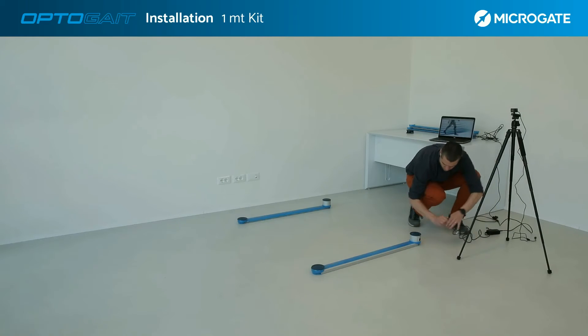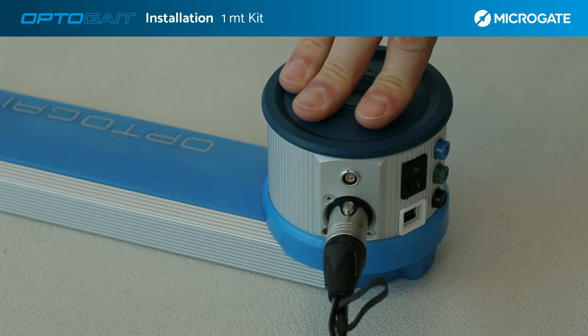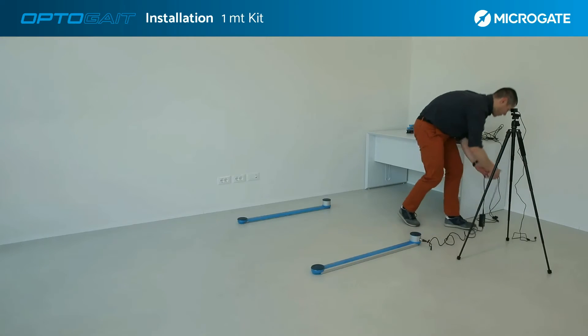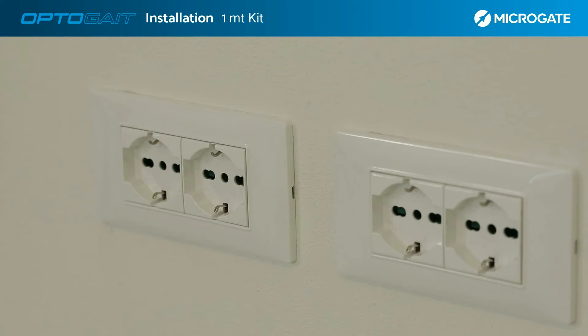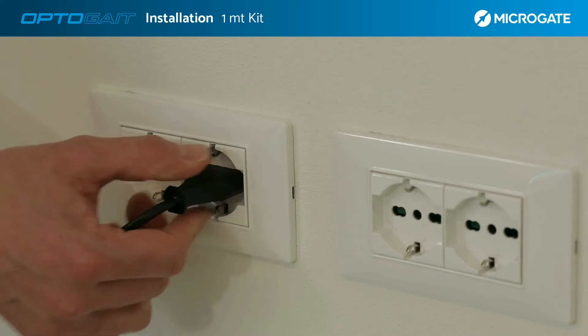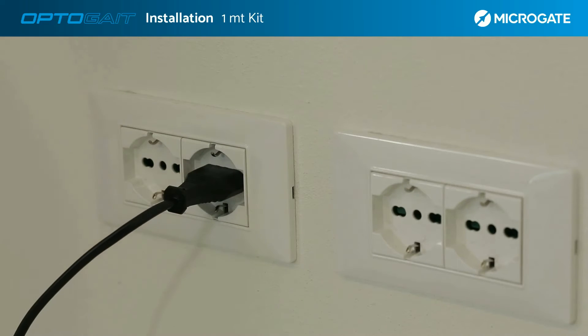If an external power supply is needed, use the supplied cable with a three-pin connector. Remember, the bars must first be switched off. It is possible to use the system when connected to an external power source — in this case, the power supply will not only power the system but also recharge the batteries.